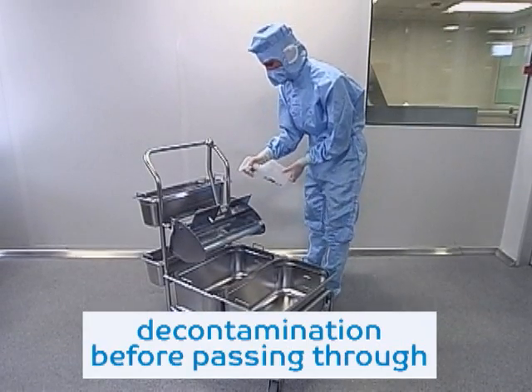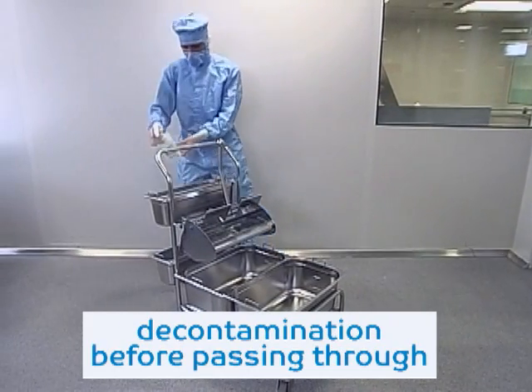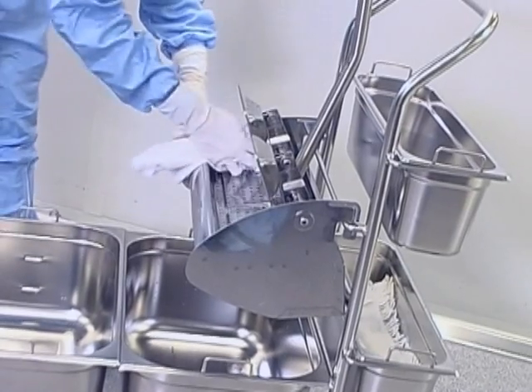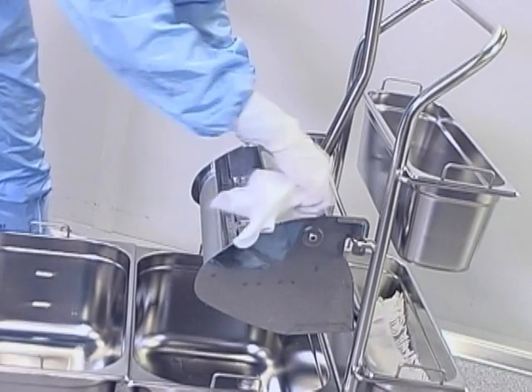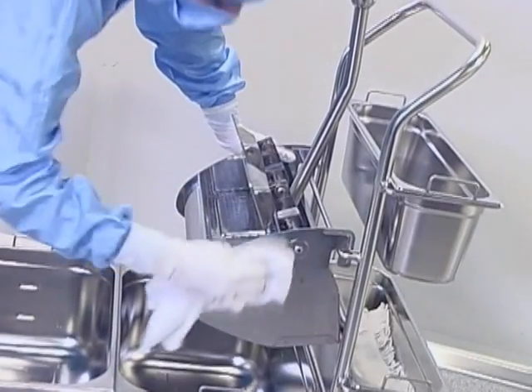The cleaning system trolley must be decontaminated before it can be used in the clean room for the first time. For the areas C and D, it is disinfected by spraying and wiping in the clean room airlock. In the areas A and B, it is sterilized before use.